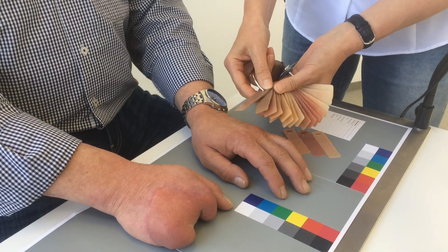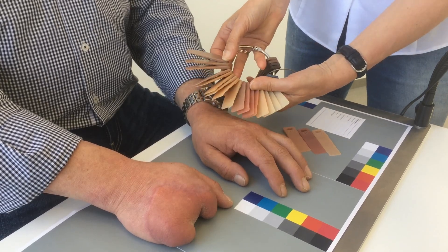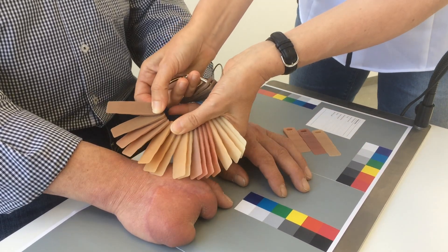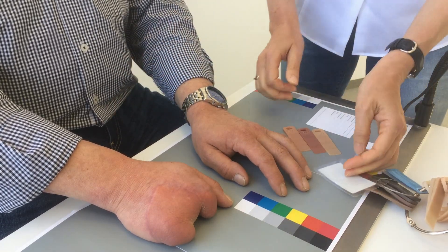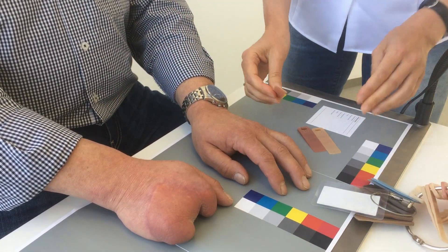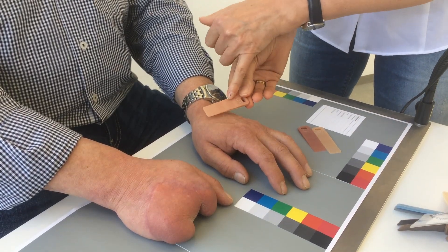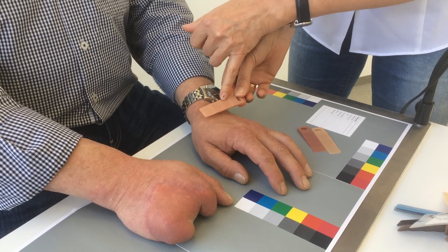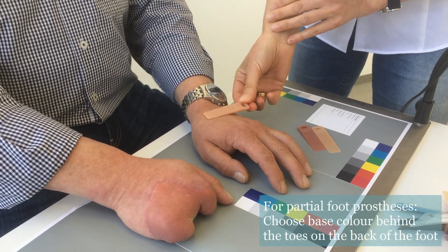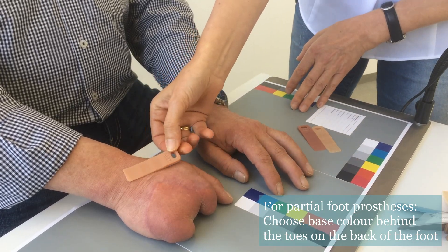I will now determine the three skin tones. I move the color ring over the back of the hand on the contralateral side and the affected side. I start with the base color. I have already pre-selected the base color, which should always be set at thickness 3 — this area of the sample — on the back of the hand, between the joints and on the affected side as well.